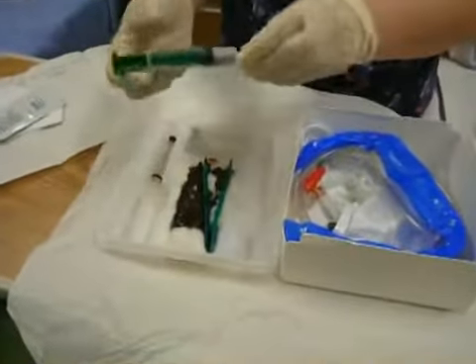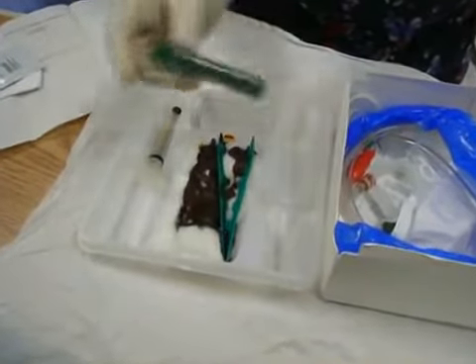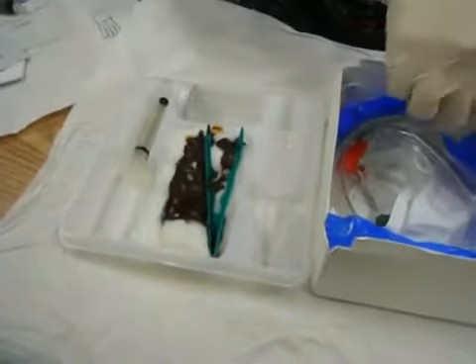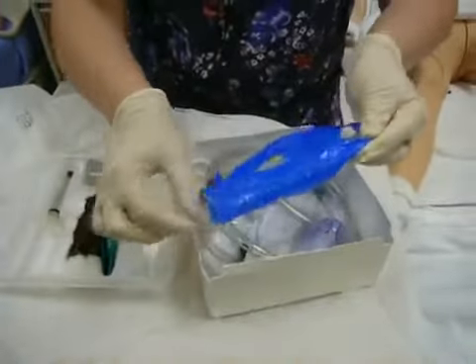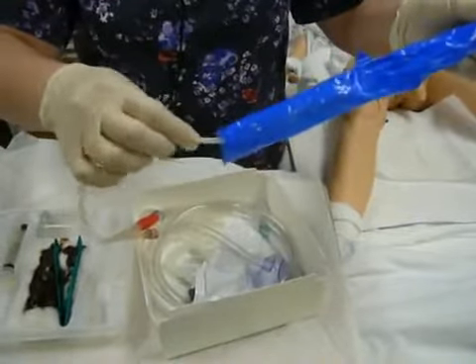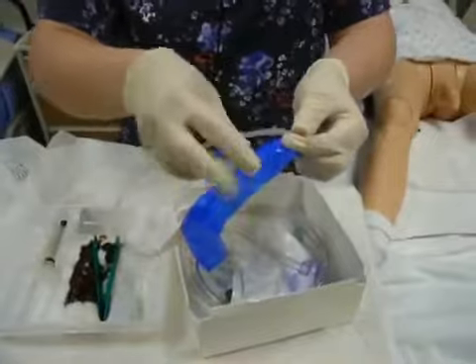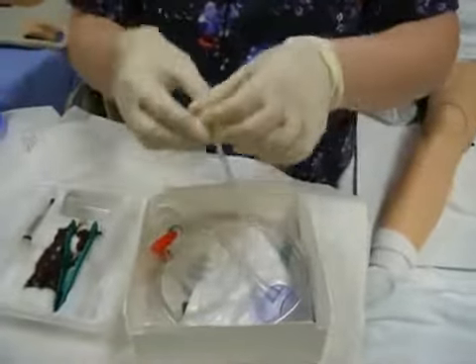I'm going to squirt my lube into this little container where the syringe was. Goes in my garbage pile. And then I'm ready to get my catheter ready. So I'm going to move over to my catheter in the box, and I'm going to take off the blue sterile covering. Now when I do this, I need to make sure that I don't contaminate my catheter. The catheter is very flexible, so you have to make sure you walk it out to maintain control of it. This blue piece is now garbage, so that goes in my garbage pile.